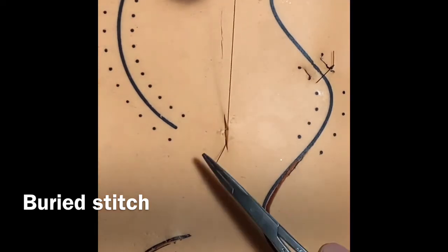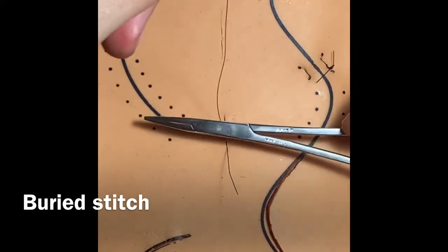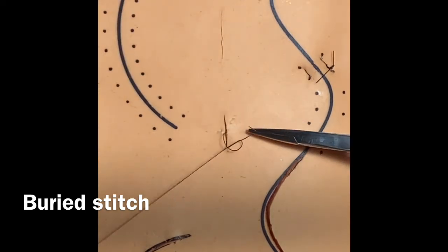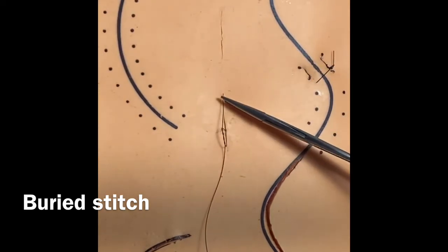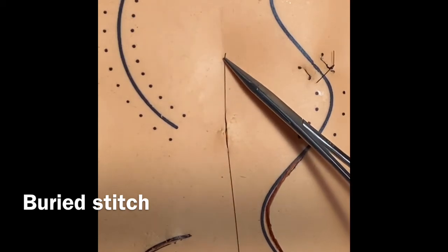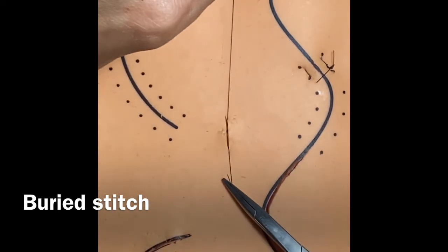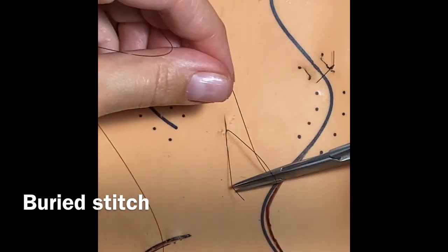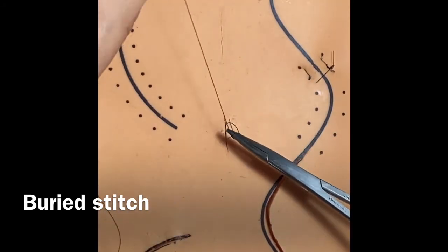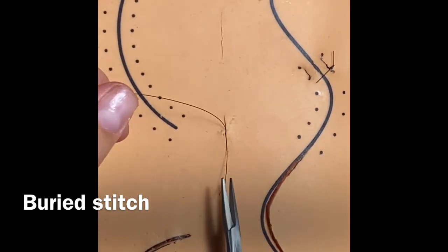So what I'm going to do is the same thing as before. So here's kind of like the V we were looking at before. Put your needle driver in between. There's your surgeon's knot. Okay, that should lay down square. You can see my square knot here, and pull it in the direction of the wound. So you pull down. Okay, same thing as before. You're going to make your 4 knots. 2, 3, and 4. Perfect. Okay, so see how that's laying down nicely, and now my tails are sticking out.